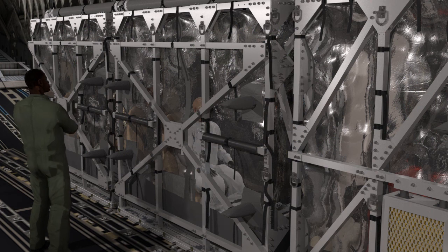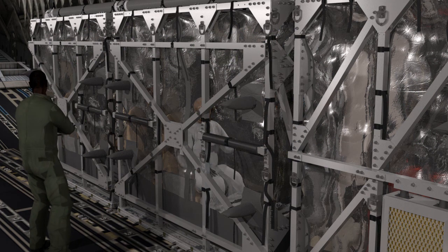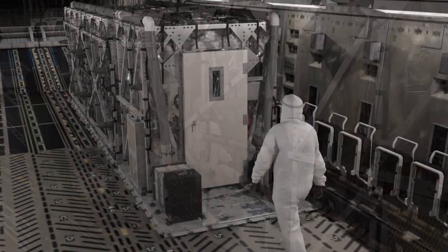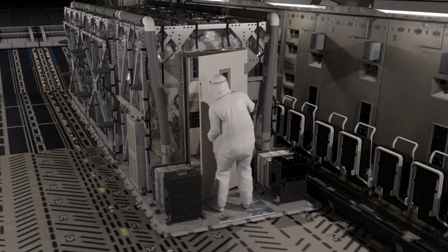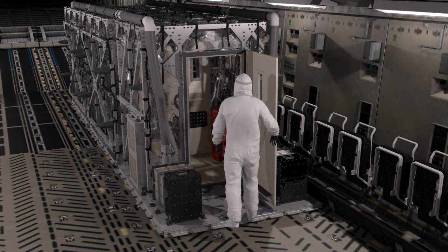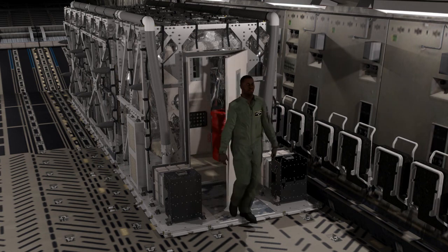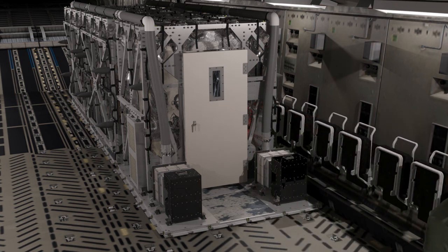The clear liner of the TIS allows medical personnel to monitor the patients from outside of the TIS. When medical personnel are required to administer patient care, they will don PPE and enter through the anteroom module. Once care has been provided, the medical personnel will decontaminate and doff the PPE within the anteroom module prior to exiting the TIS.